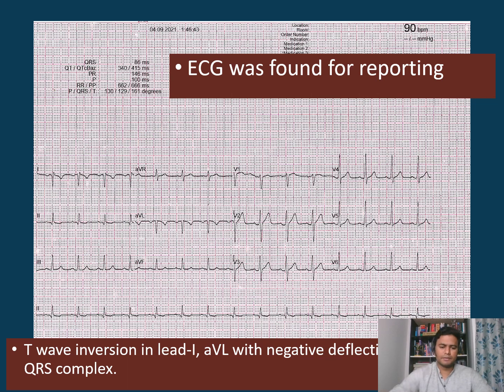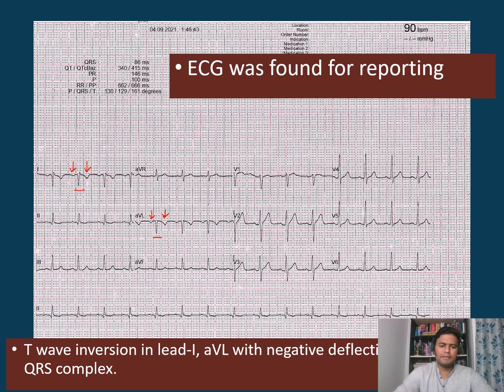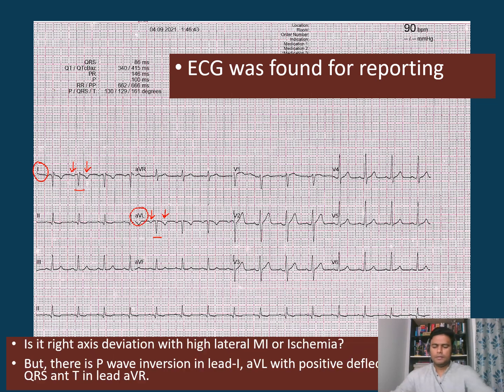Let's take a pen so you can see the T inversion in lead I — right here — and also the inverted P, which we'll check later. Same for lead AVL: there is a T inversion, the QRS is also negative, and the P is also inverted. So everything is inverted in lead I and in lead AVL.